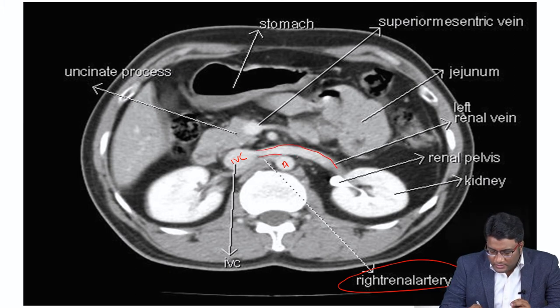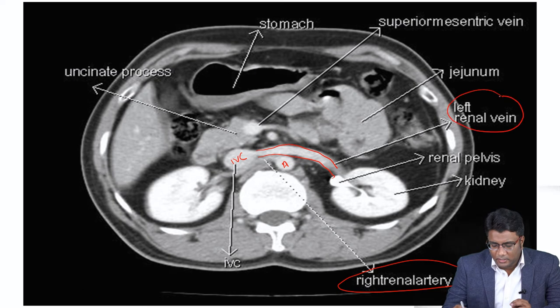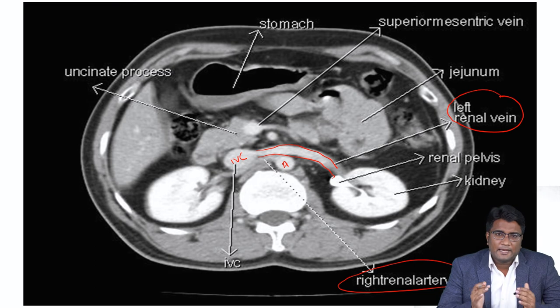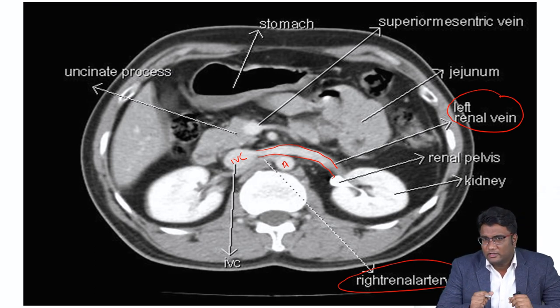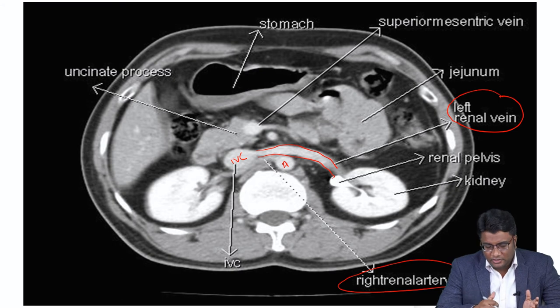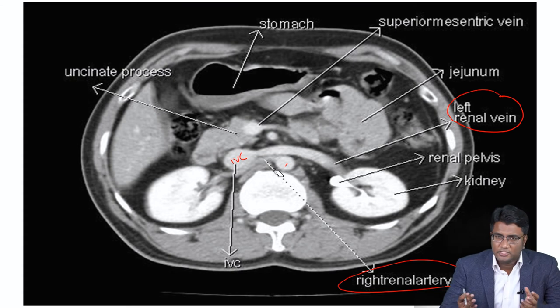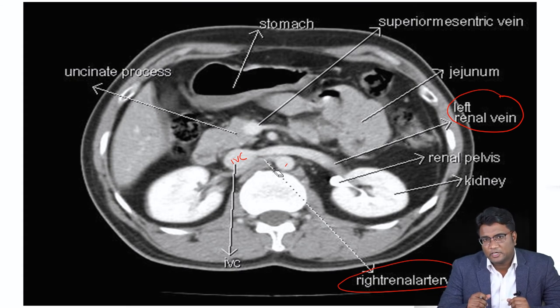From the inferior vena cava, this vein coming towards the left kidney would be the left renal vein. You should be able to tell which is the renal artery and which is the renal vein by tracing them back to the aorta or back to the inferior vena cava. The right renal artery traces back to the aorta, and the left renal vein drains into the inferior vena cava.